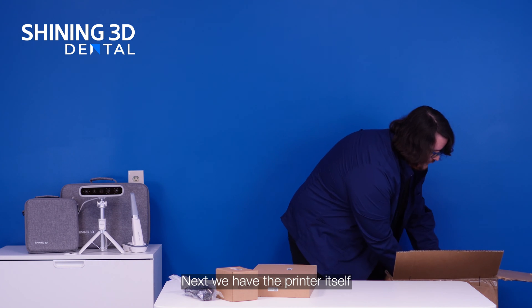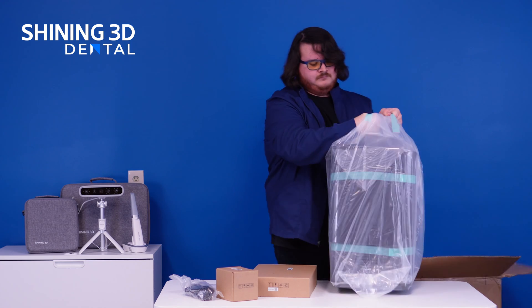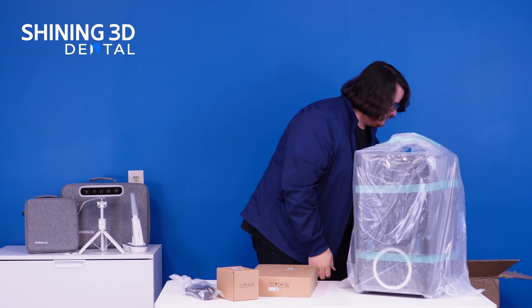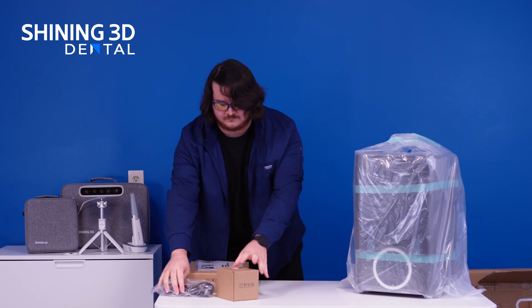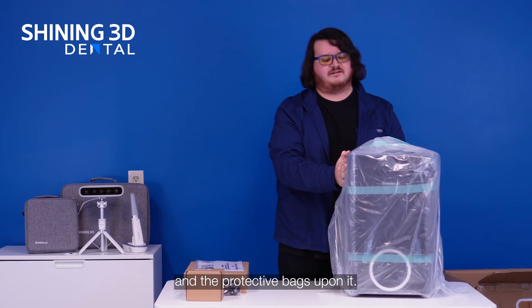Next we have the printer itself, and we'll remove the protective bag that's on it.